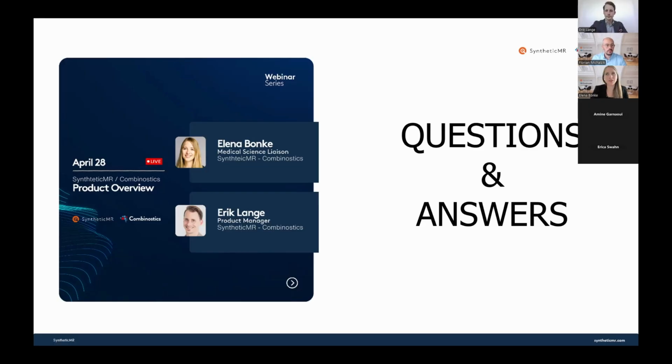Yeah, very good addition, Erik. And I also have one more thing that I would like to add, because we have our, as I mentioned before, we have our cNeuro web viewer.